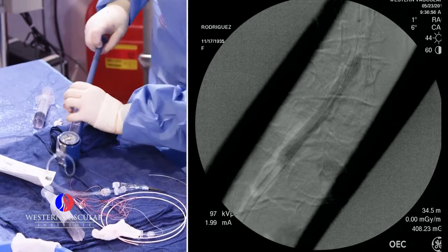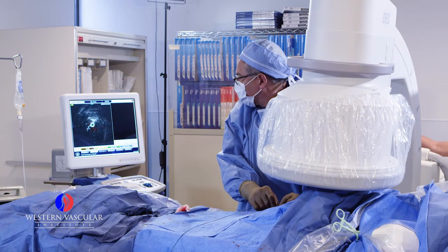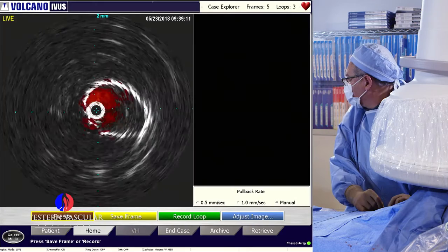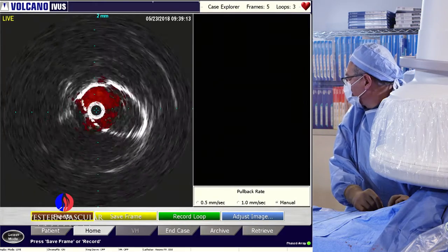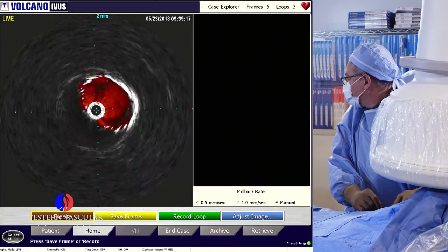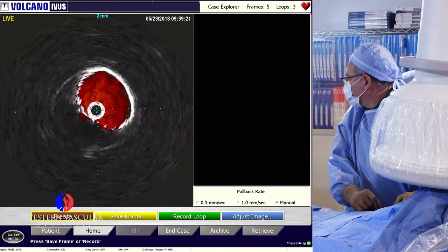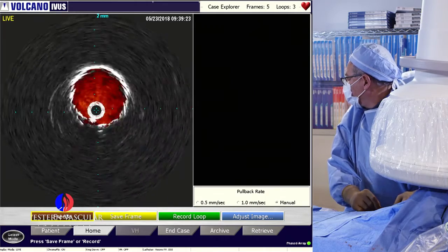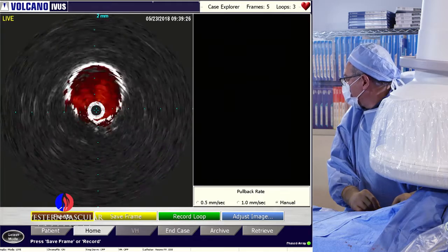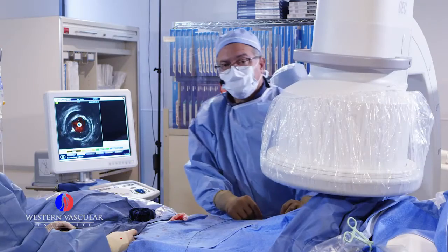Down. All right, so right in the order you can see the flow. So that's our new stent. It's definitely better flow and better lumen. Actually, it looks good. It's not as collapsed as the first stent was. I think we had a pretty good result.